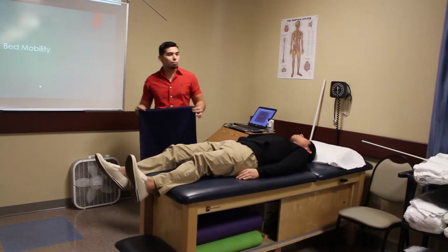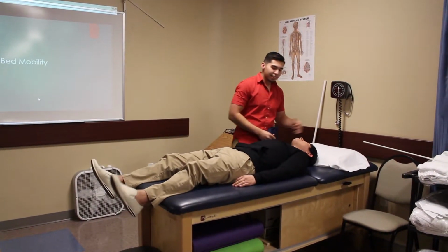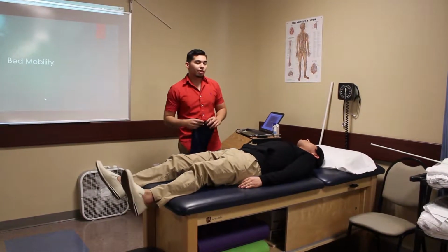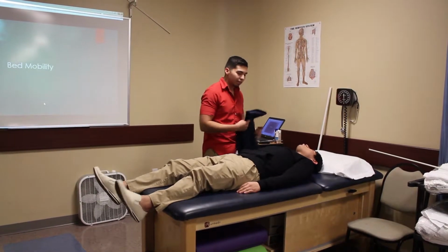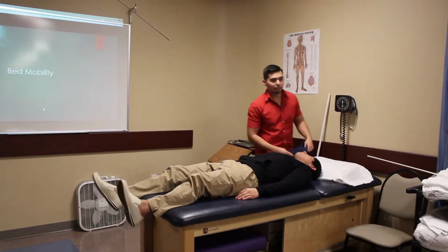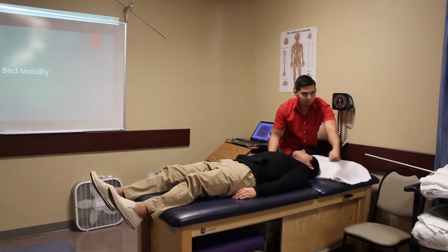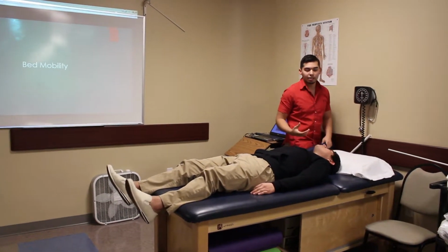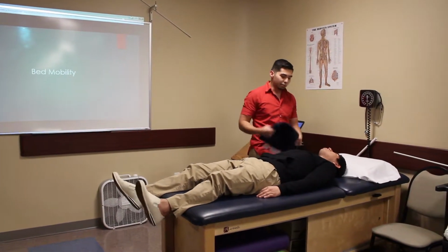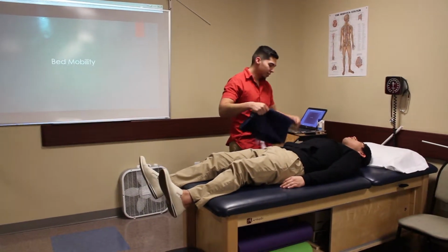Usually when you transfer a patient onto the bed, they're not going to be all the way at the top of the bed. They'll usually be halfway or a little bit lower, but most of the time you have a pad under them. If you work in a hospital or acute care setting, you usually stand behind them and pull it up, but that's a lot of strain on your back. If there's another person with you, you grab one side each and pull them up. With the low friction sheet, the patient will be doing it himself. You just let them know what to do.